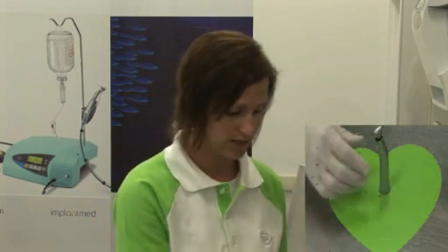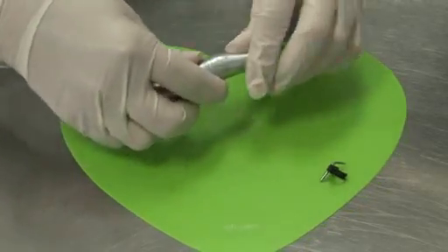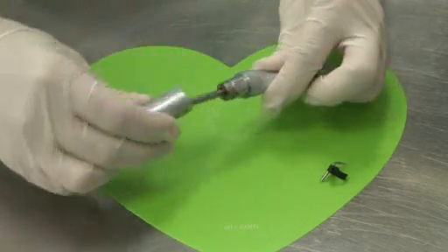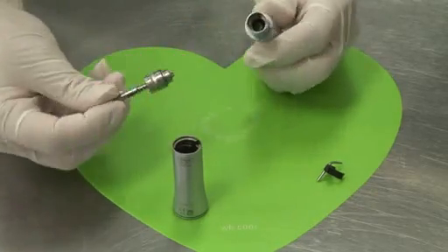Please remove any drill and treat separately. First, remove the spray clip. Using both hands, grab onto your handpiece and twist towards yourself, removing the sheath, then the rear gear assembly.